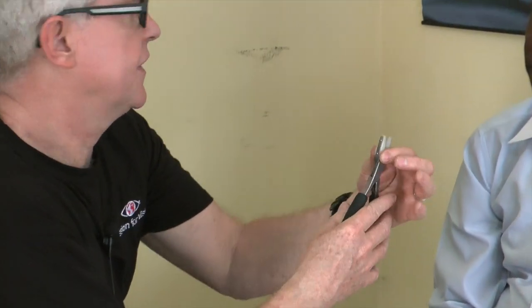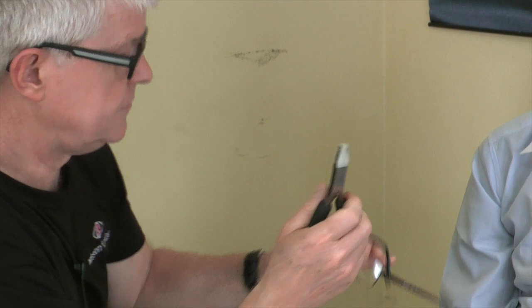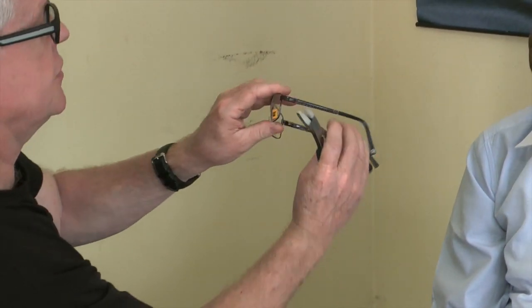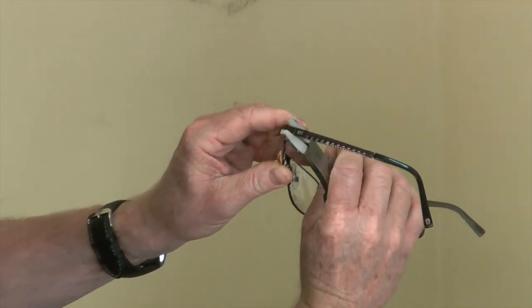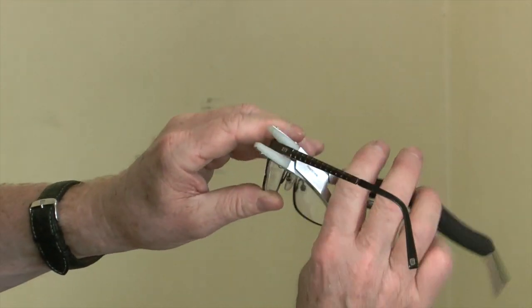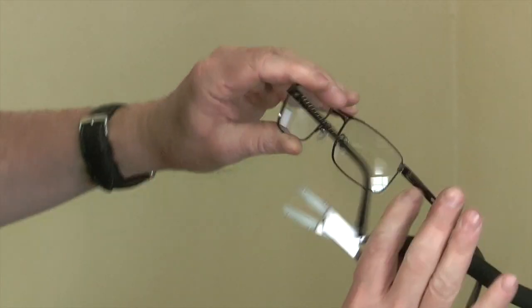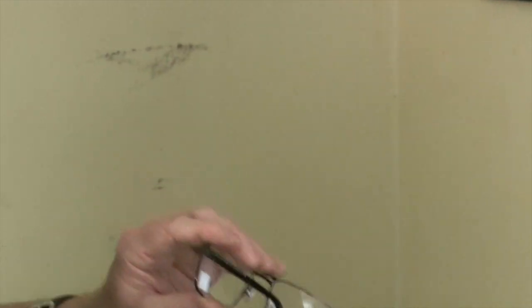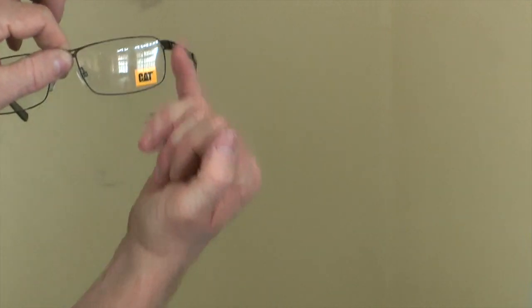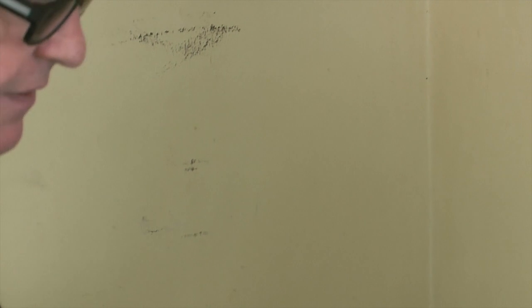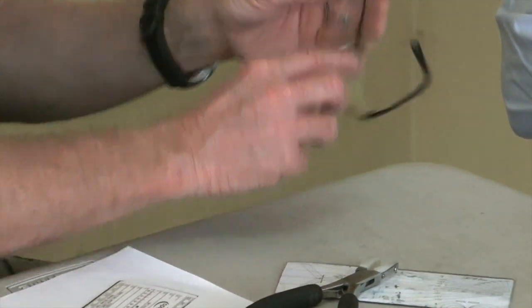We use these pliers — the ones that have got the nylon fitting on them — and the reason for that is so you don't scratch the frame. What you do is you place those pliers on the lug and then you can just bend it gently and alter that angle. You can see that the angle has been increased between the side and the front. If I put the glasses down, they won't be the same because I've altered one of these.